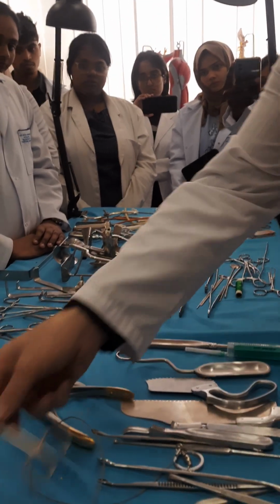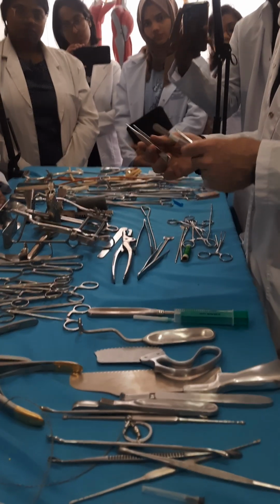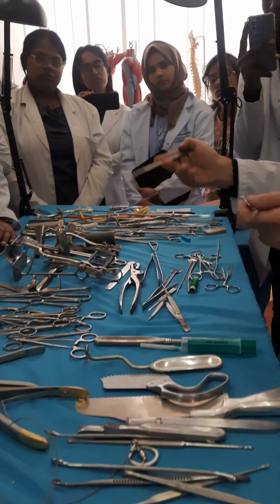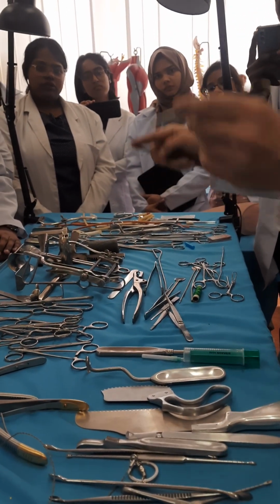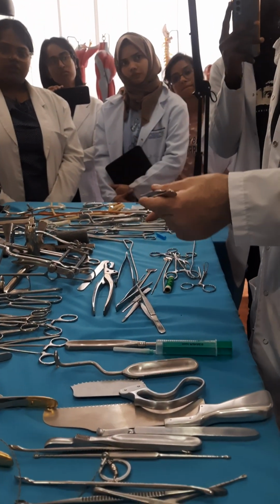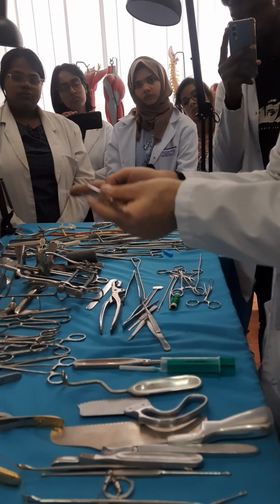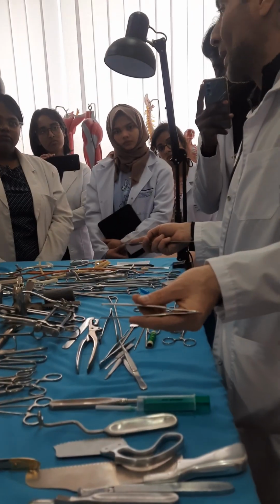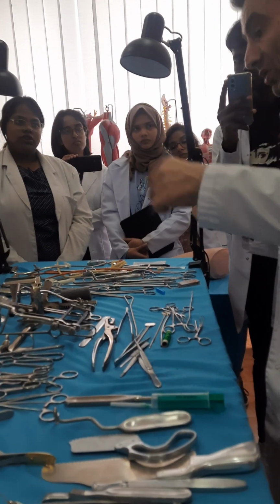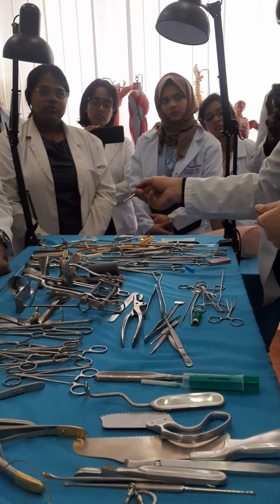Let's put the instruments in their places to not mix everything. Dissecting forceps, it is, I can say, second most useful. What is the classical picture of any surgeon? In one hand, we have scalpel, yeah. In another hand, we have dissecting forceps. Why dissecting? Because when you cut the structures, you need to hold, you need to tense, you need to move. Usually these two instruments we use together. But not only. I cannot say that this instrument is used only for dissection. No. Generally to fix the structures, to remove foreign bodies, but anything else.